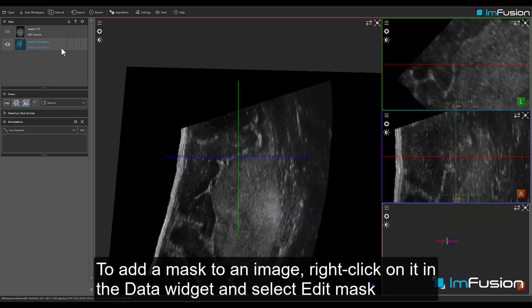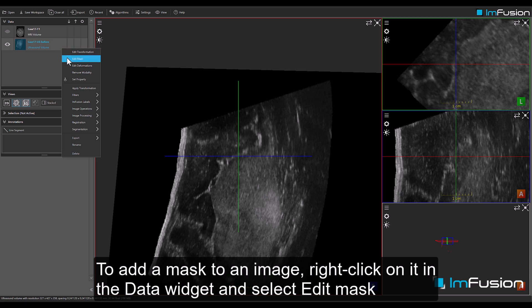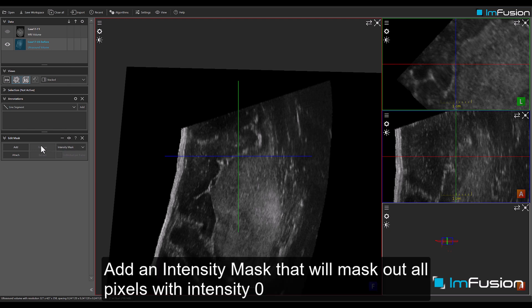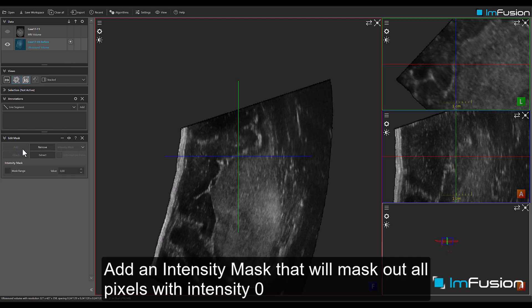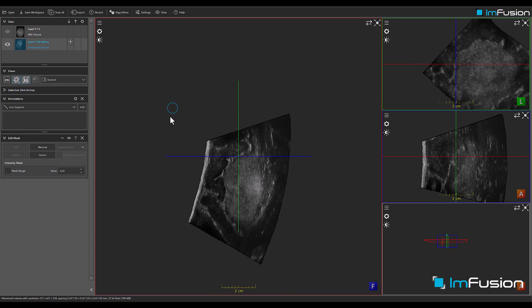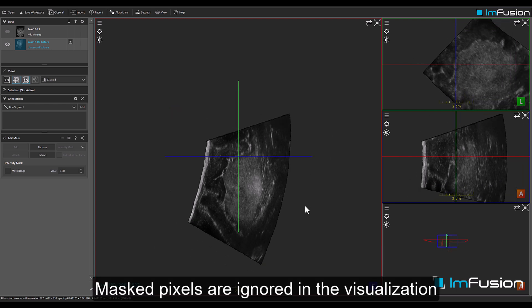To add a mask to an image, right-click on it in the data widget and select Edit Mask. Add an intensity mask that will mask out all pixels with intensity 0. Masked pixels are ignored in the visualisation.